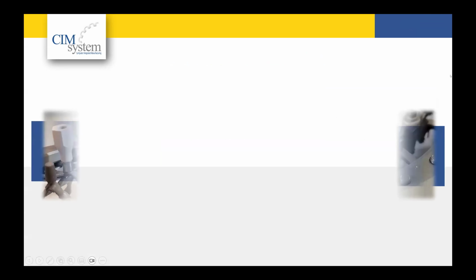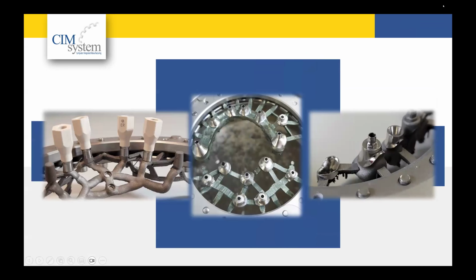Lastly, I want to show you a couple of cases that we have here. Those are real cases. On the left side, we have a case with a scan body inserted in the connection. In the center, we have an implant bridge, a bar with attachments, and some abutments. On the right side, we have a multi-unit, an implant case, and a simple crown.